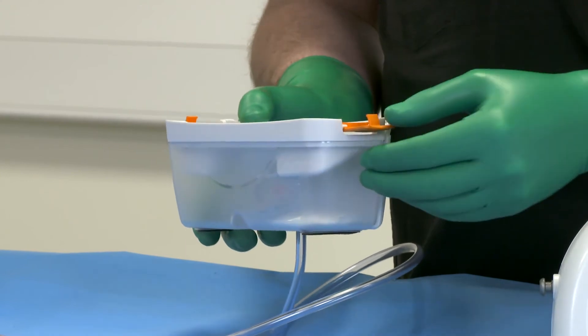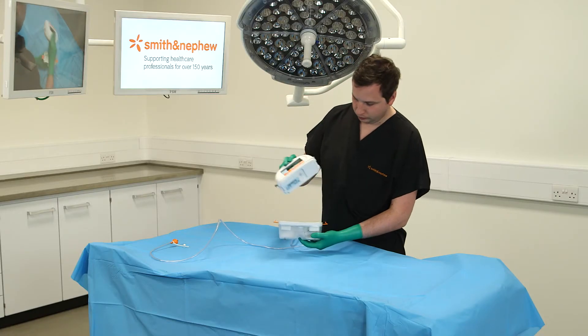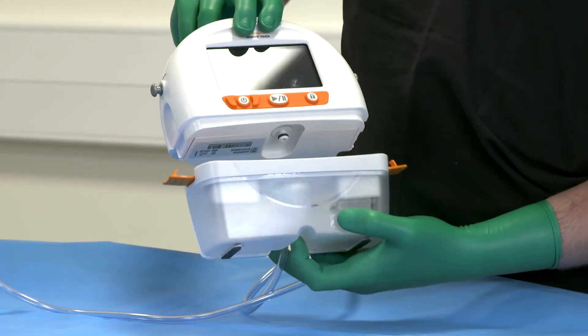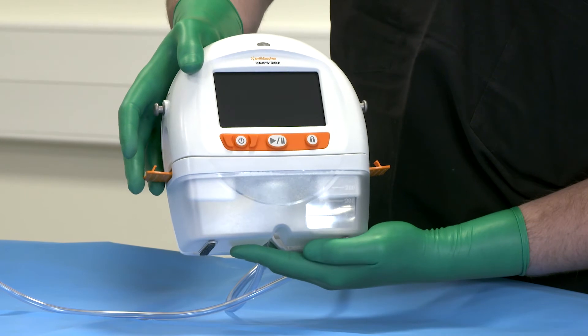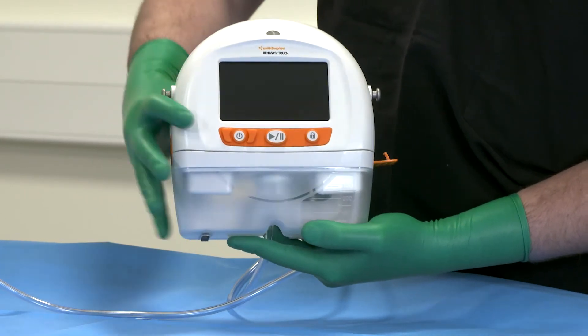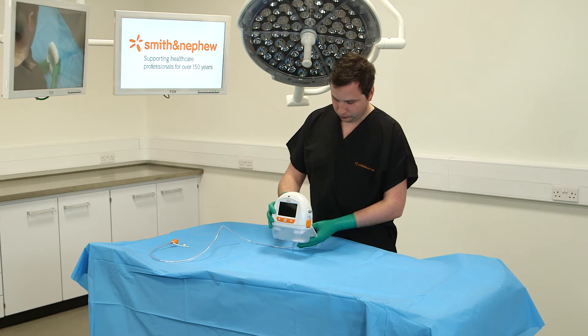Open the canister clips on both sides of the canister. Position the canister so that the viewing window is facing forwards. Push the canister gently over the inlet port on the bottom of the device. Engage both canister clips. The canister clips will click when properly engaged.